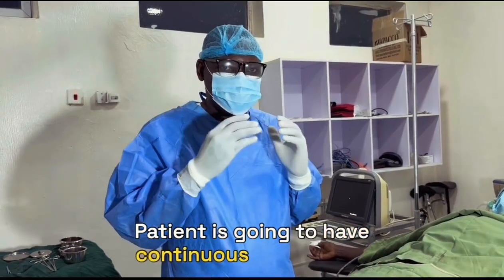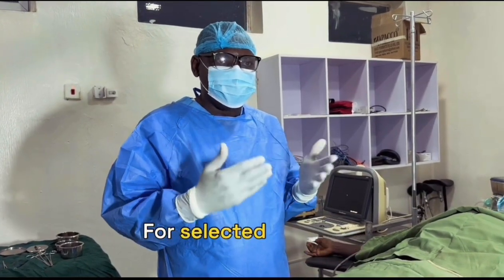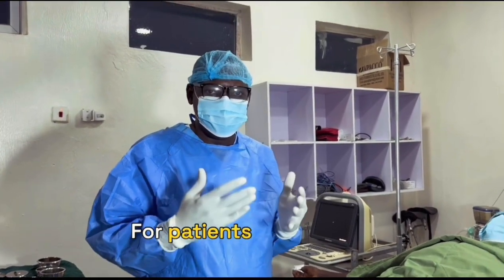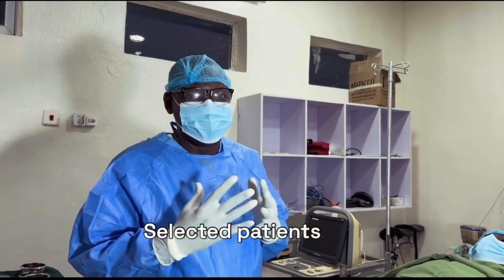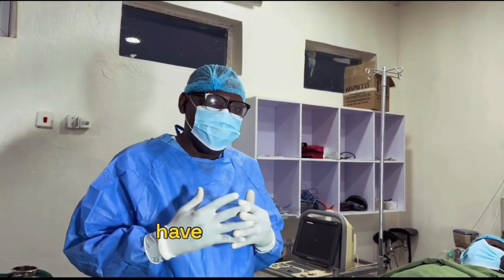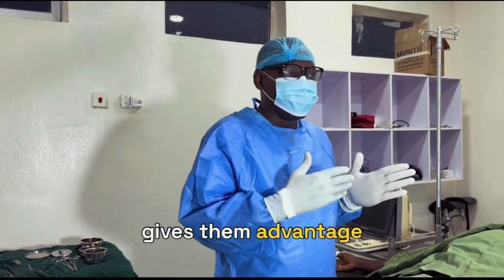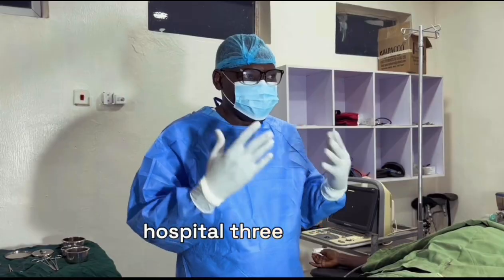Patient is going to have continuous ambulatory peritoneal dialysis (CAPD). For selected patients, CAPD is a very good option for patients with kidney failure. CAPD affords selected patients the opportunity to have dialysis in the comfort of their home. It gives them an advantage over hemodialysis, where a patient will have to come to the hospital 3 times a week.